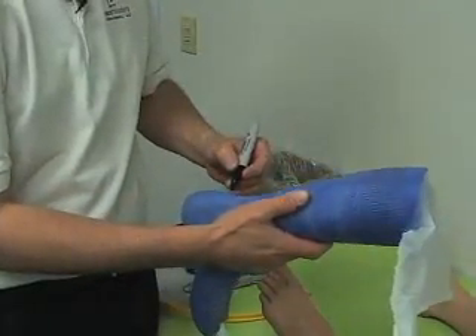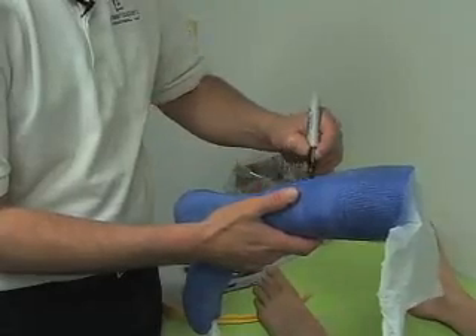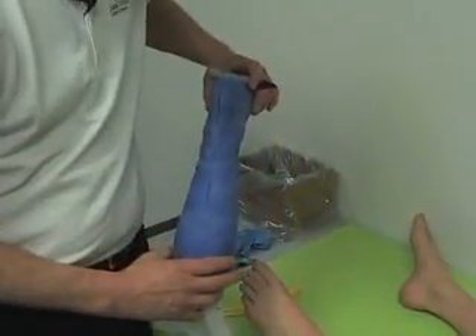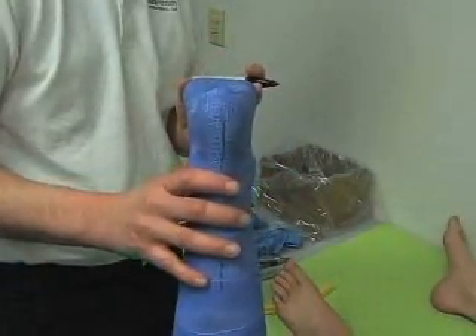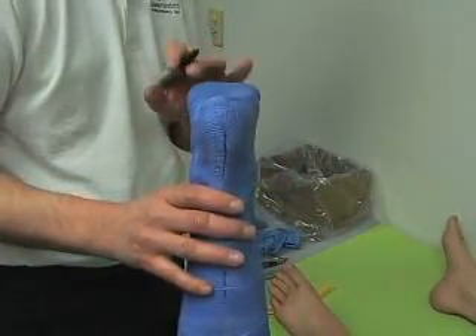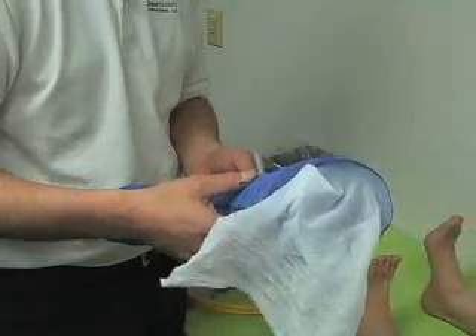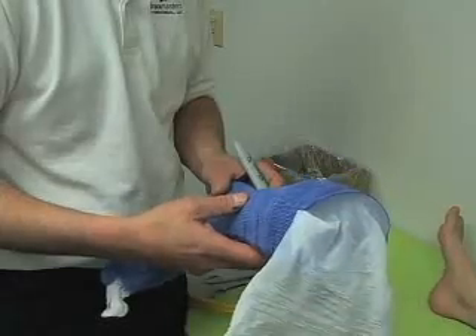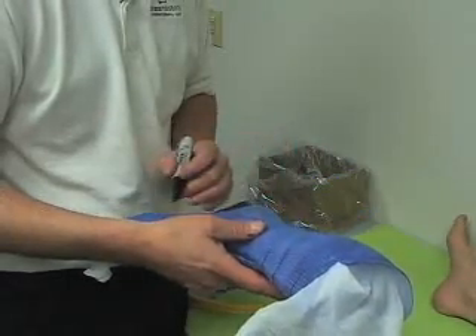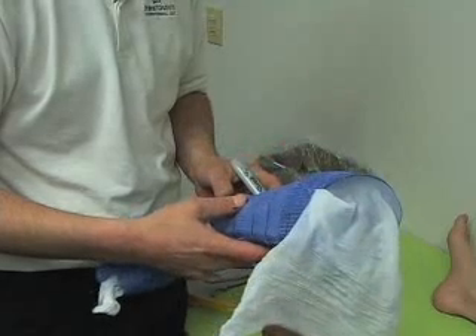As you can see with what we tried to achieve, there is a vertical heel to the cast. You can see the forefoot alignment based off of that, with this being slightly supinated. Check your cast to make sure the alignment is what you want. You can check on the order form whether or not you want us to change it or leave it as is, based on your evaluation.